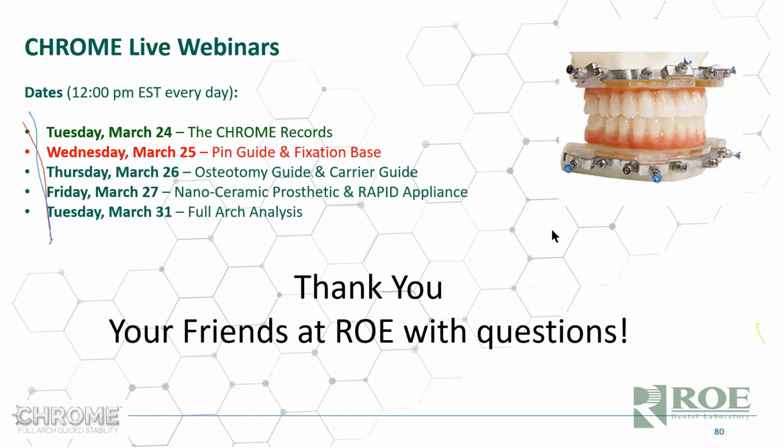Do you need bite registration or cotton during edentulous scan? You always want to have the patient biting in occlusion. That's very important for edentulous scans. In fact, a lot of cases, they just stop at that point. So put the denture in the mouth, make sure it seats perfectly, make sure the occlusion is good, have the patient bite together, put them on the chin rest as opposed to the bite fork, and take the scan.